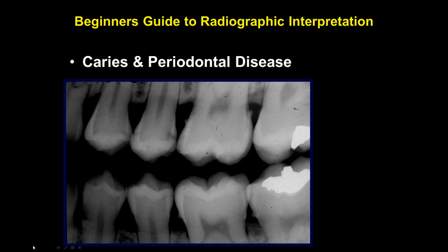And please excuse my voice, it's going in and out, but remember we were talking about the density of the patient. We know that the posterior region of the patient's head is much more dense or thick compared to the premolar region. If we expose the image with the same level of intensity or radiation, you're going to see this section of the film is a little bit lighter compared to this section of the film. Therefore, you wind up with some kind of radiolucent burnout. This is very indicative of the region that is being exposed here.